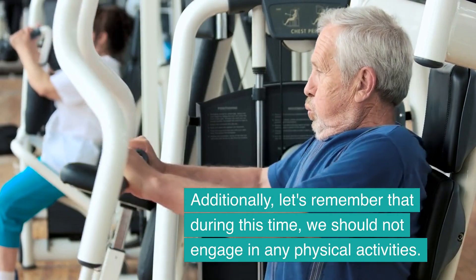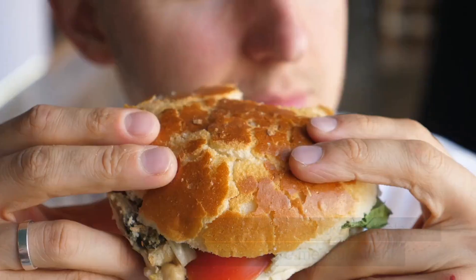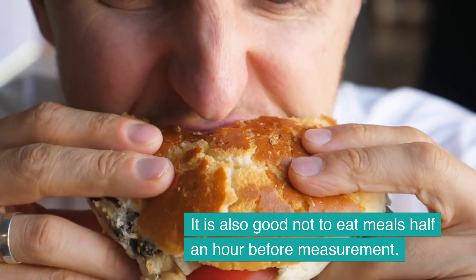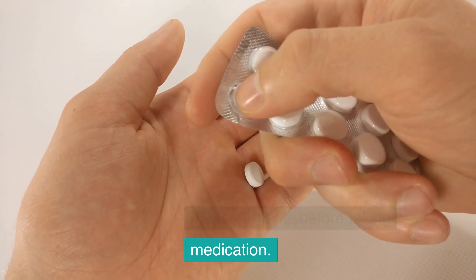Additionally, during this time we should not engage in any physical activities. It is also good not to eat meals half an hour before measurement. Moreover, we perform measurements before taking medication.